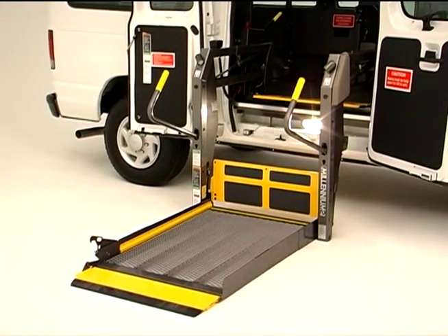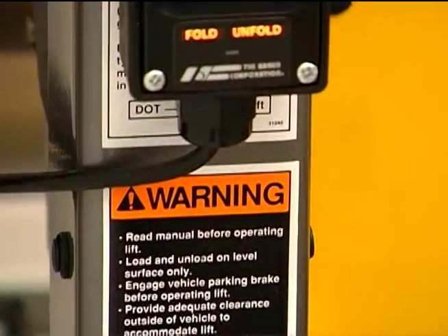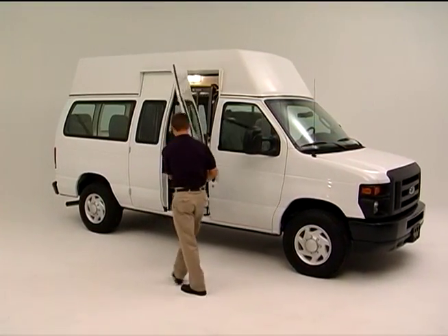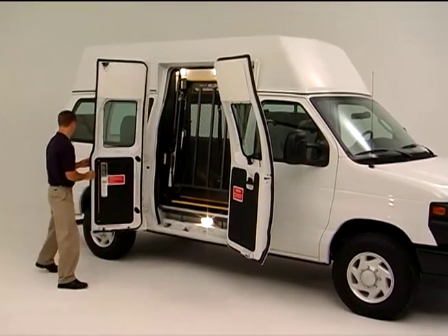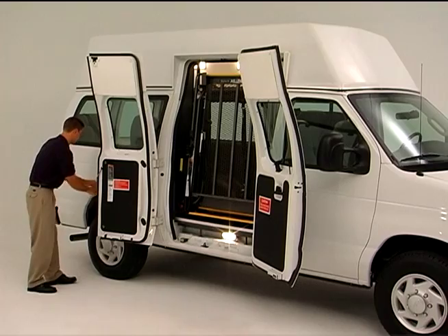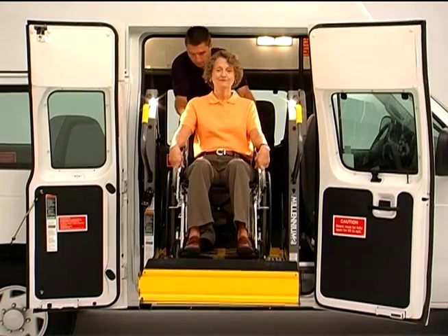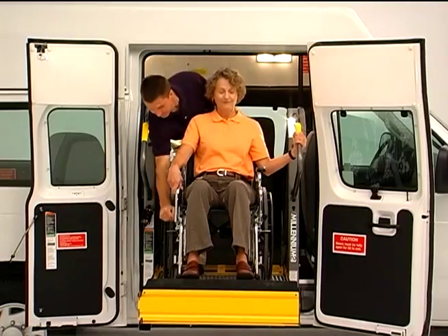In addition to watching this video, we recommend that you read your lift operator's manual and that you also pay close attention to the information and safety decals on the lift itself. Before attempting to use your lift, we strongly suggest that you examine the unit carefully and notify the carrier immediately if you notice any damage that might have occurred in transit. If you notice damage, don't use your lift until any problems have been resolved or you've received confirmation from Braun that the lift can be safely used.